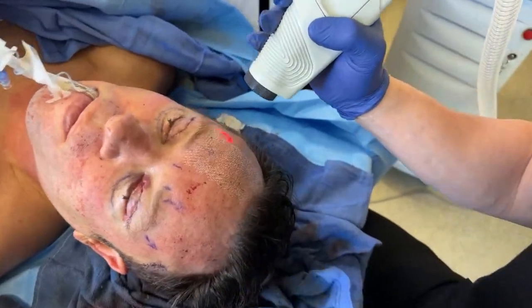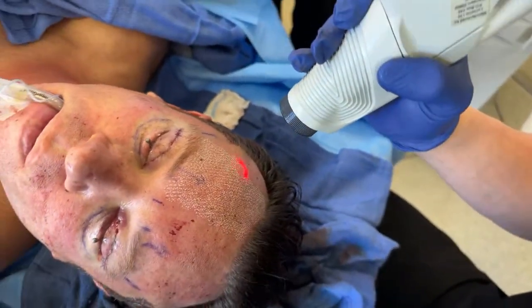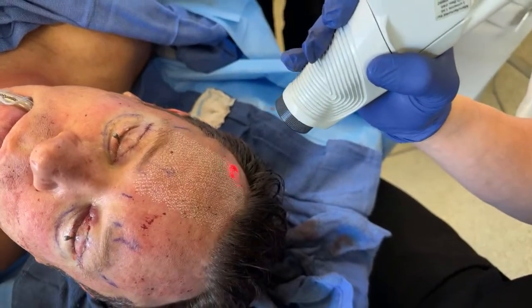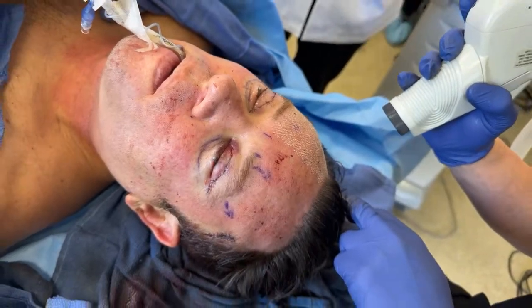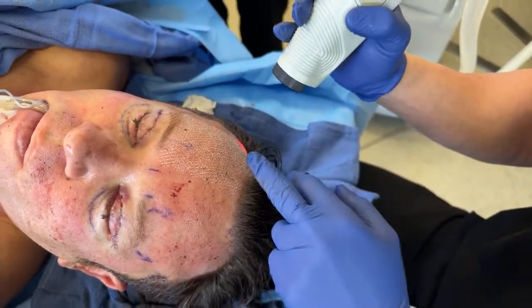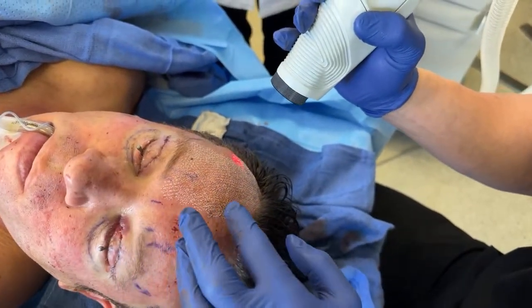Now we're doing our laser resurfacing. So this is our tight and bright, and the cool thing is you could do this treatment while under anesthesia or awake in the office. But because he had his eyelids done, why not get laser at the same time, get the overall full rejuvenation done? So we're working right now on his forehead with our CO2 resurfacing, and then we're gonna go around his eyes. You can see the eye shields are in place.